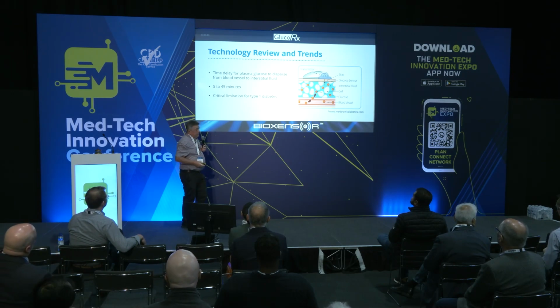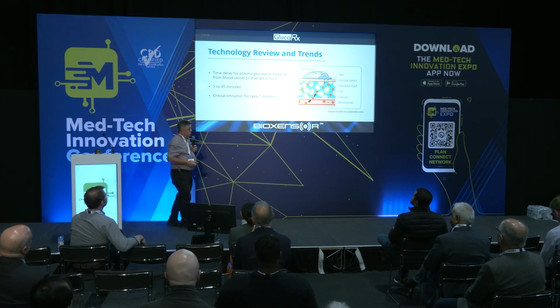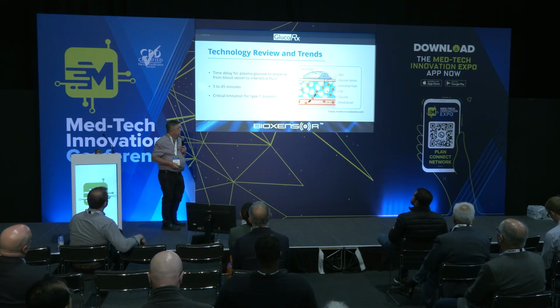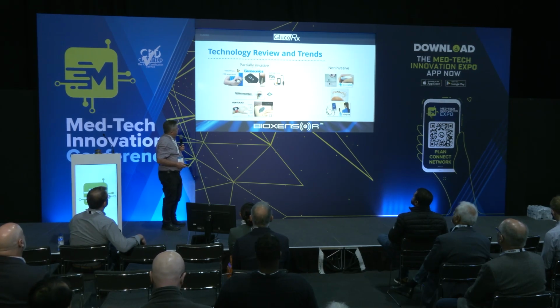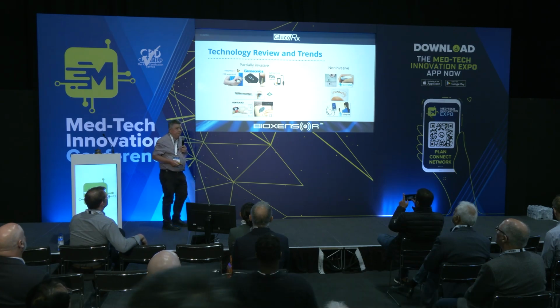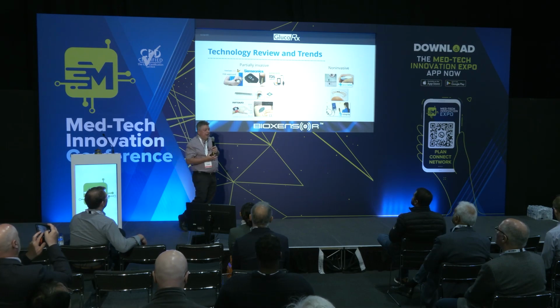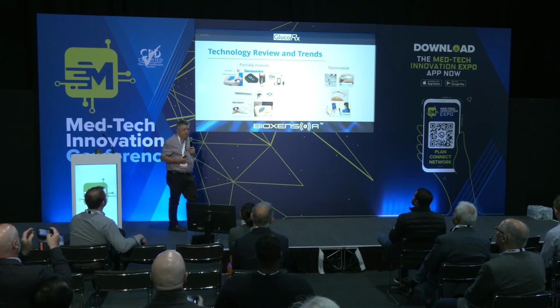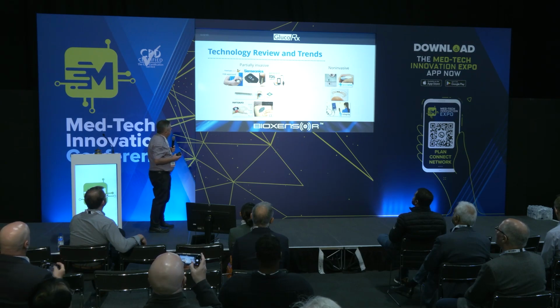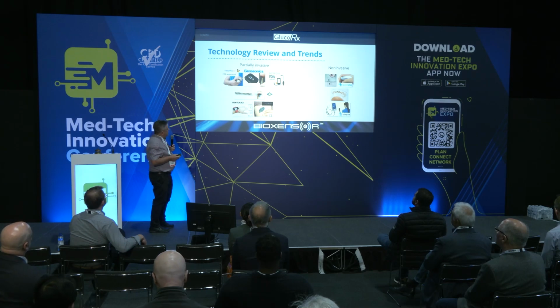The delay, depending on the other types of minimally invasive methods, depending on what you're probing, can be as long as 45 minutes. And what we've got here is a sort of overview of some of the partially invasive type sensors. Some of these involve microneedles, so they may not involve pain, but they certainly involve the exchange of bodily fluids. So we've got things like the Freestyle Libre there, and the Dexcom type CGMs.